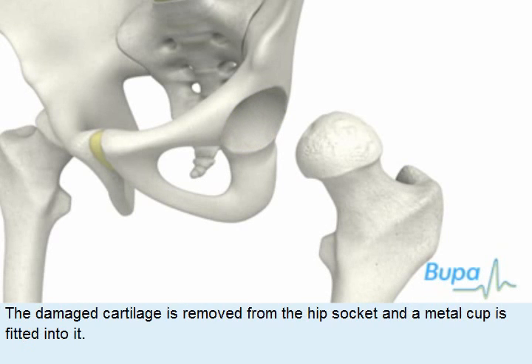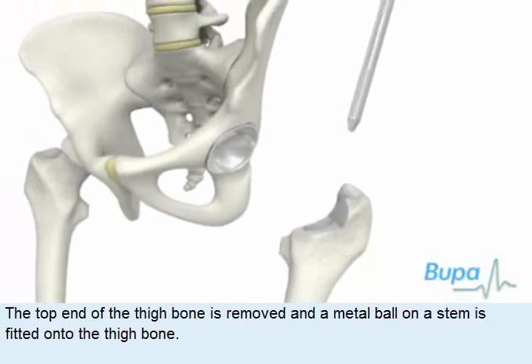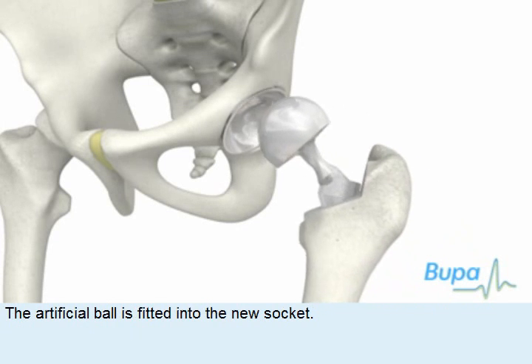Damaged cartilage is removed from the hip socket and a metal cup is fitted into it. The top end of the thigh bone is removed and a metal ball on a stem is fitted onto the thigh bone. The artificial ball is fitted into the new socket.